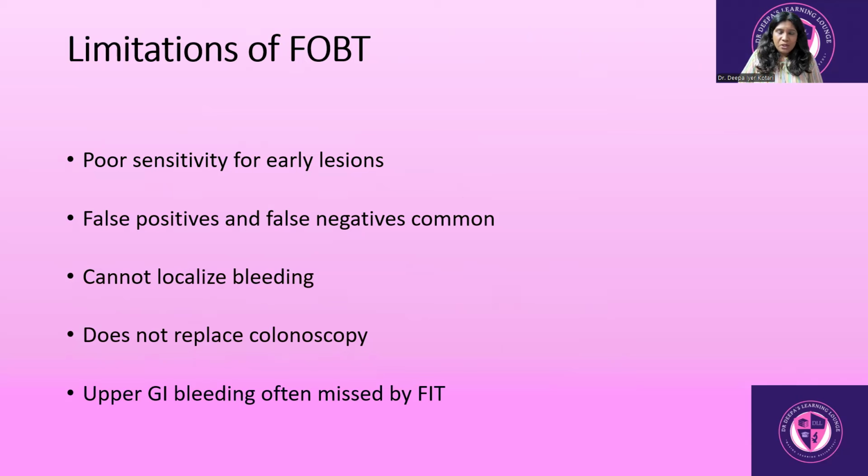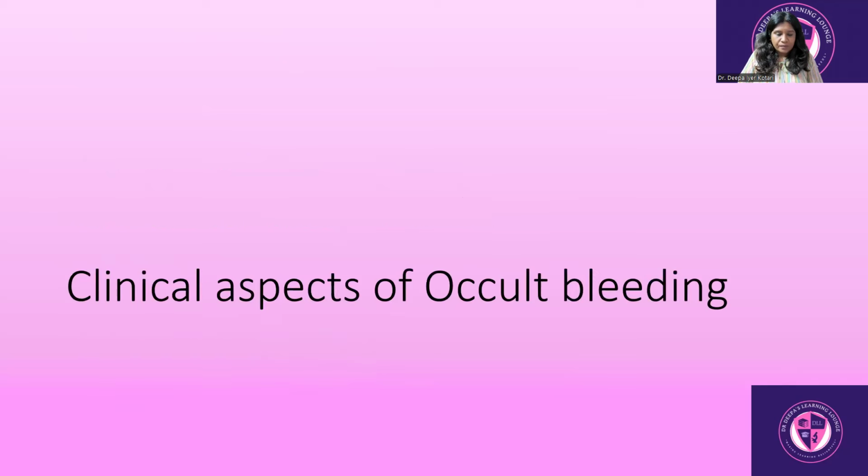What are the limitations of fecal occult blood testing? These are the various methods which we spoke about, but there are some limitations. It is not exactly a complete diagnostic test. It cannot determine where the bleeding has originated from, and it cannot replace any imaging or colonoscopy test. It is only a screening test. The false positives and false negatives and the limitations are quite significant. Therefore, it is only a screening method.